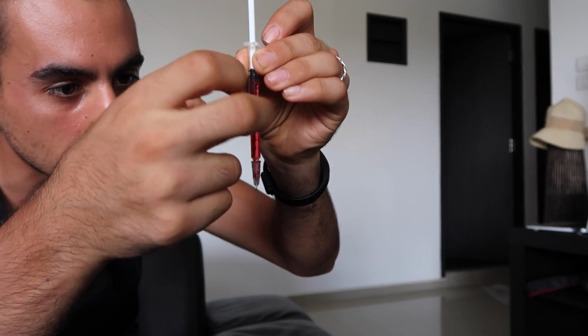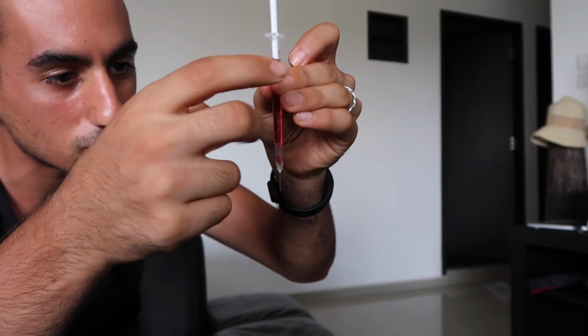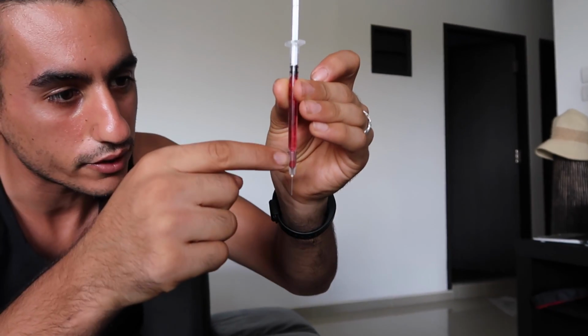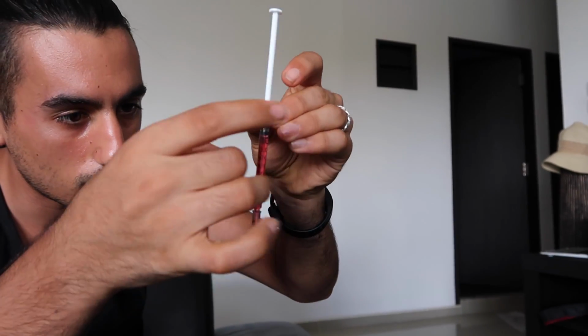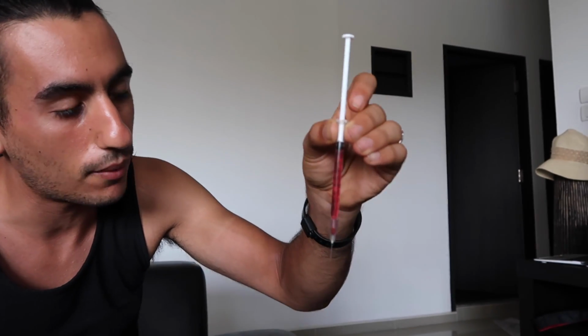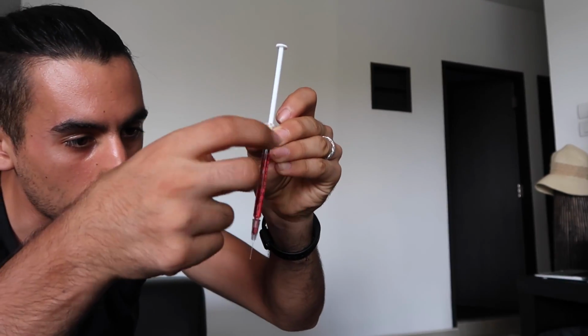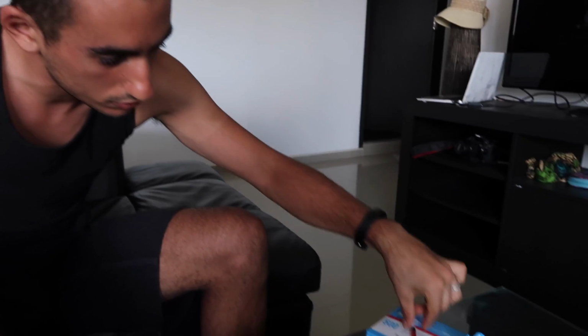But with these needles, that's not a problem because you're never going to be able to squeeze all of it out because of this bit here. So that's actually fine, believe it or not. But your needle might be different, so you might want to try and get everything out. But essentially, that's it. And now we've got B12 all the way through here when we squeeze it through. So this needle is now prepared with the syringe.